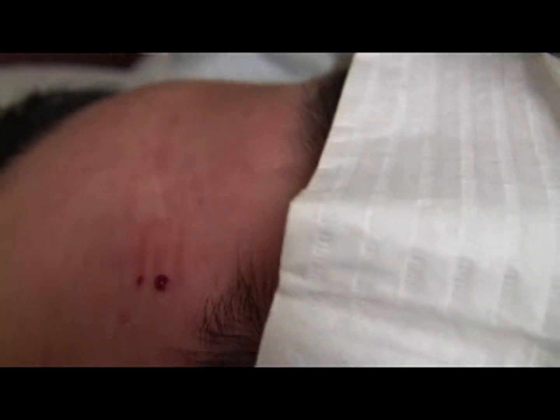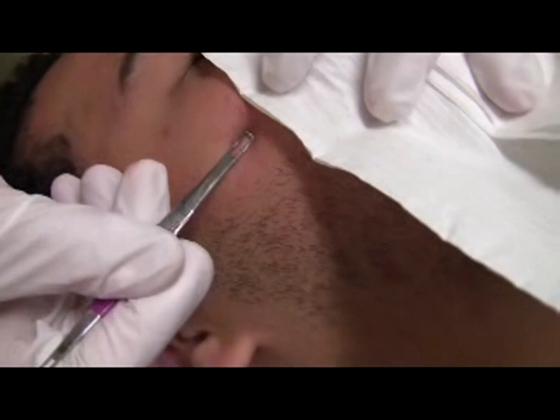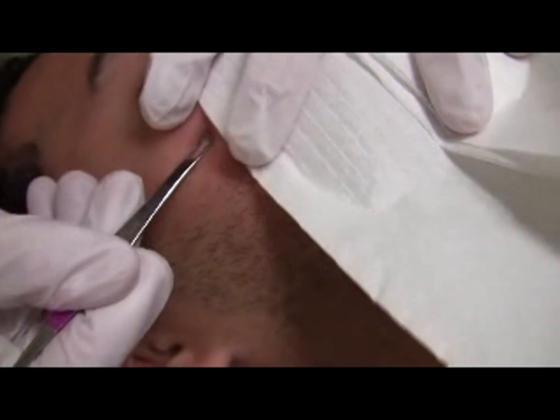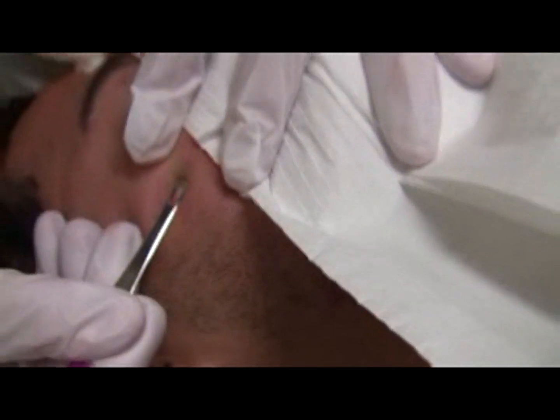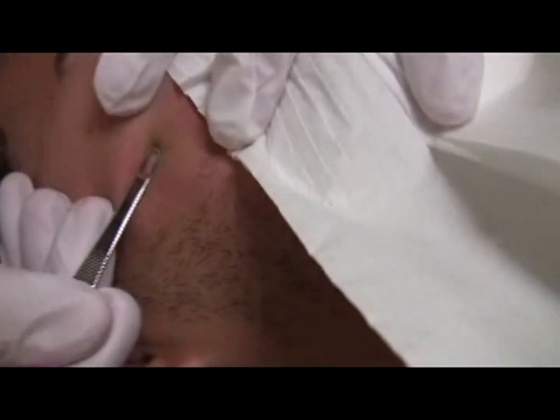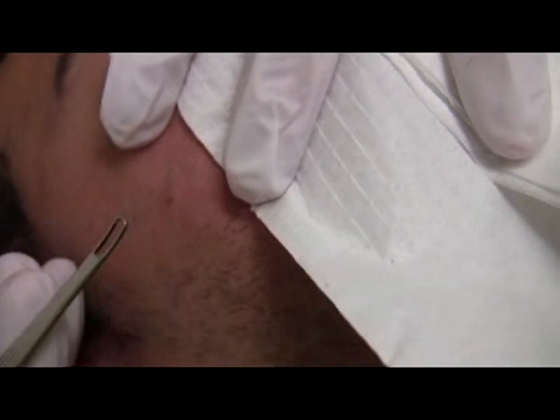For the cheeks, don't be shy, but be aware that excessive pressure can actually cut or tear the skin. On the cheek there's a lot more give, so I have to put a lot more pressure, but I have to be careful not to put too much pressure because I don't want to cut the cheek.